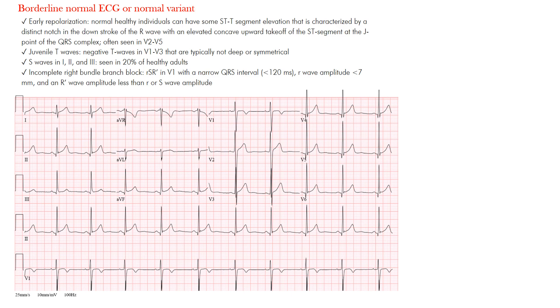Here we have our borderline normal ECG or normal variant. The purpose of these videos is not to explain every aspect of the ECG — this is a quick reference guide. The goal is to ensure you understand what these codes we use are, because this is how it works in the clinical setting: the computer reads it first, then we have our text, then the physicians over-read it. These are the codes used on board exams as well.